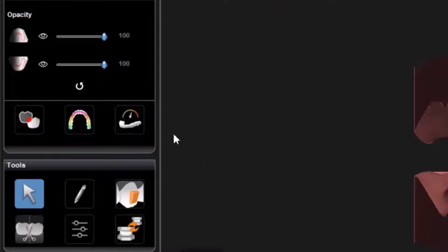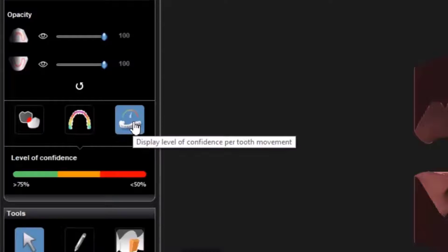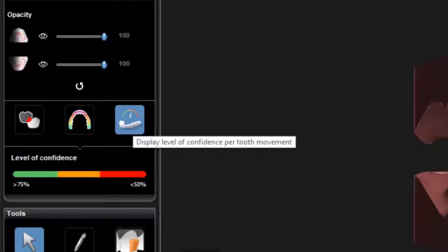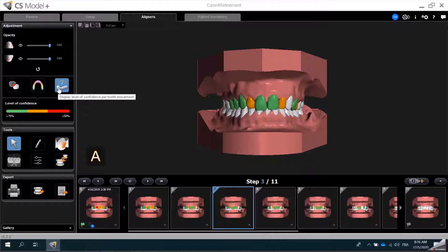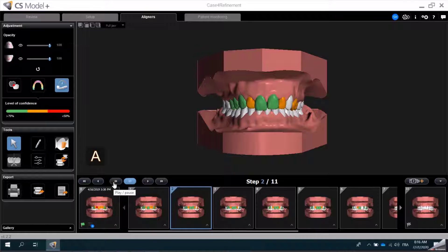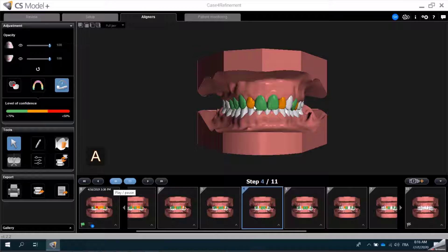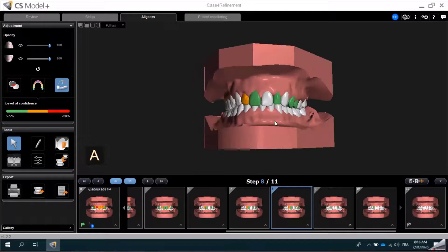Next, I'll click the display level of confidence per tooth movement button, which allows me to view the level of confidence for each step of the treatment plan. I can place the sequence on a loop and view an animation. Because it's a 3D animation and not a video, I can also rotate the model as needed to review the tooth movement, and I can adjust my settings as needed.